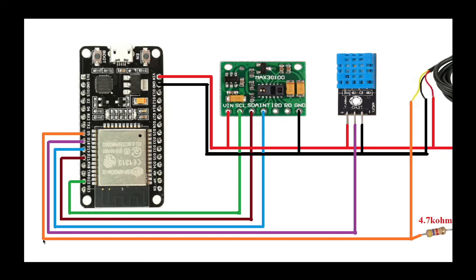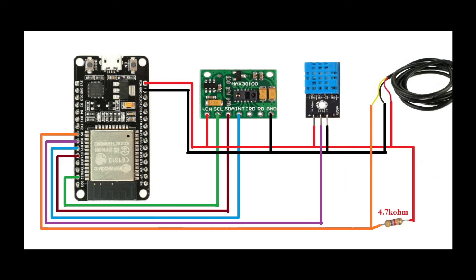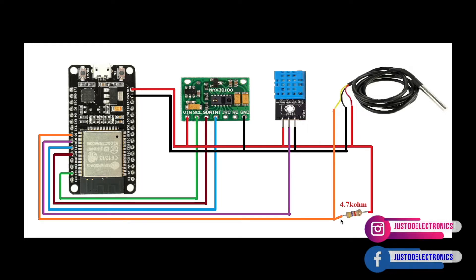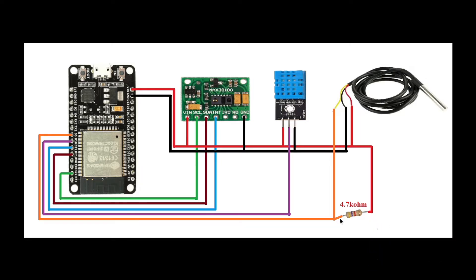The DHT11 output pin is connected to pin D18. The DS18B20 digital temperature sensor, which is a waterproof sensor, measures only temperature and is connected to pin D5. I also placed a 4.7 kilo-ohm resistor directly connected between VCC and the D5 pin.